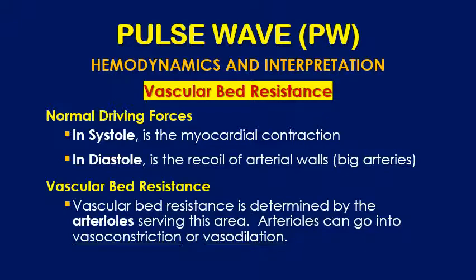Now we come to another point that we need to discuss, which is the resistance of the vessel, or what you call the high resistance or low resistance. Before discussing this, we need to know something about two opposing forces. One is the driving force, the delta P, the pressure gradient or the energy gradient on one side, and on the other side there is the resistance. So these two forces are opposing each other.